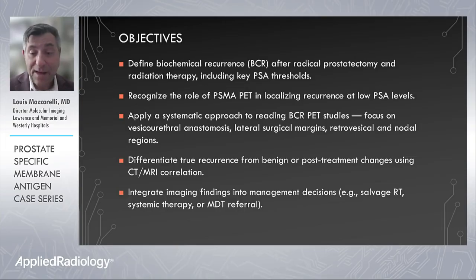Integrate imaging findings into management decisions, i.e., helping use PSMA PET to determine the need for salvage radiotherapy, systemic therapy, or multidisciplinary tumor board referral.